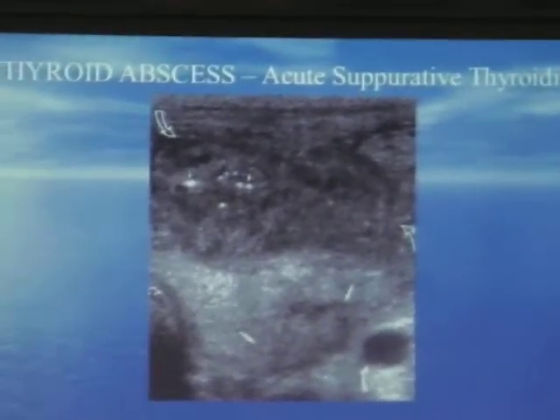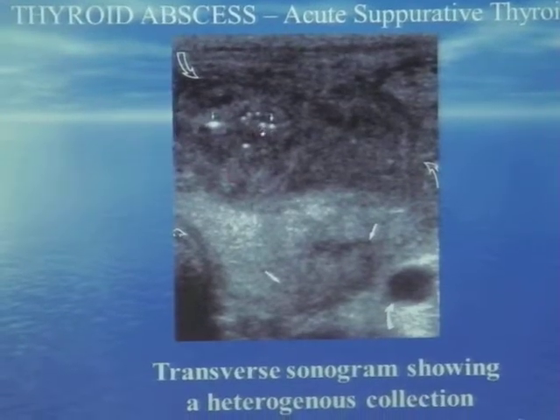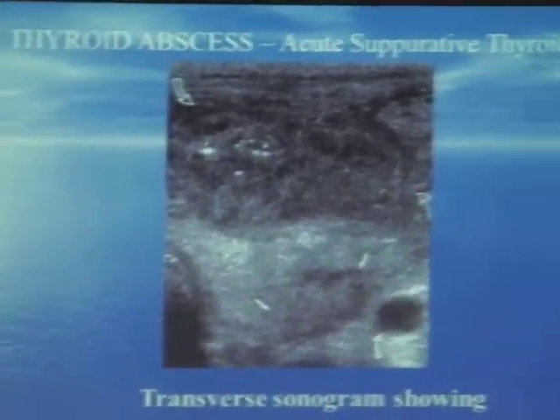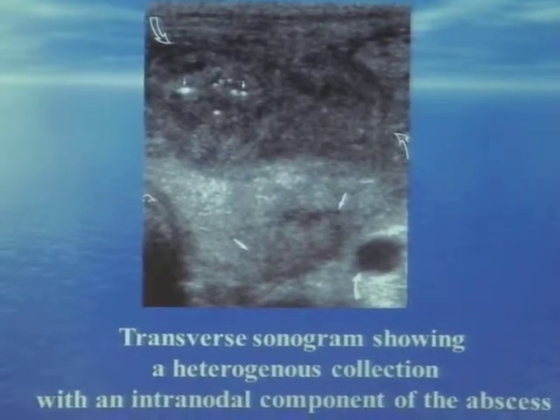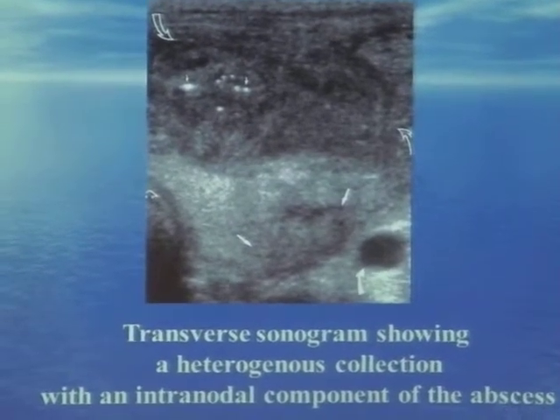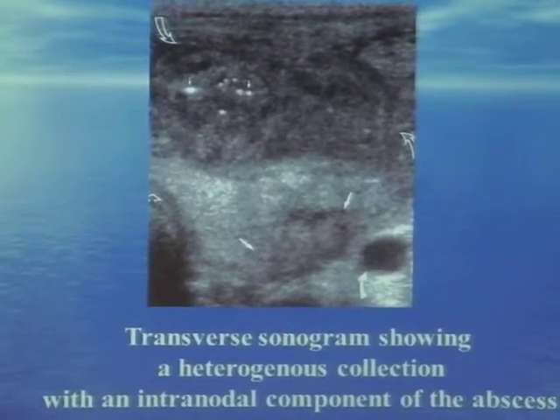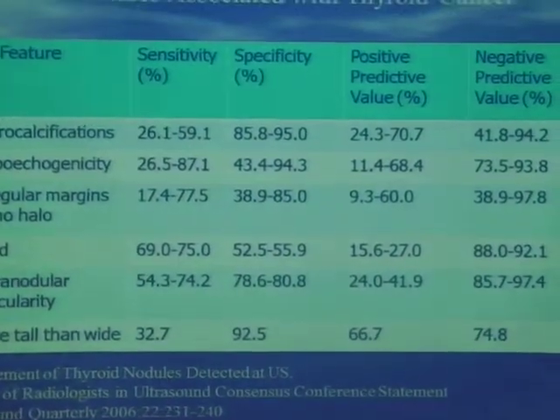Right, abscesses, just like abscesses anywhere on ultrasound, you will see a hypoechoic mass and you'll see these dots. This is not punctate calcification, but this is air. Right? Spots of air which you see inside an abscess, and if you hold your probe on the thyroid, you can actually see the movement of the pus, and there will be no movement otherwise. But here you would see, and of course clinically, if the clinicians think that this is an abscess, it confirms the diagnosis, right?